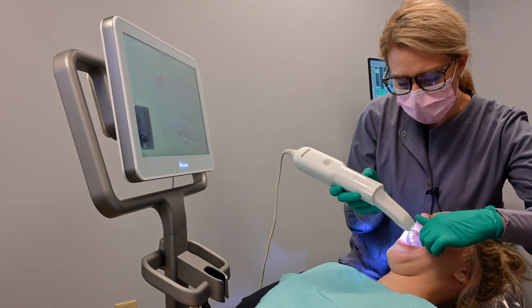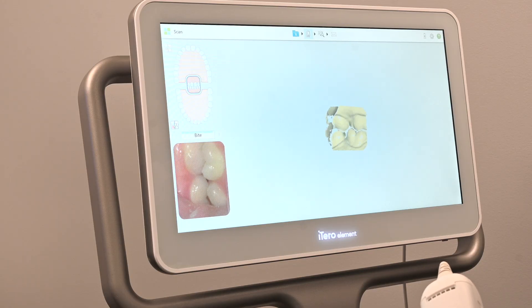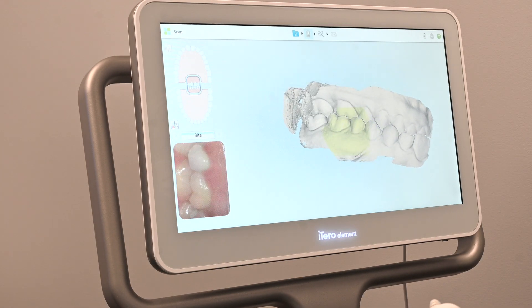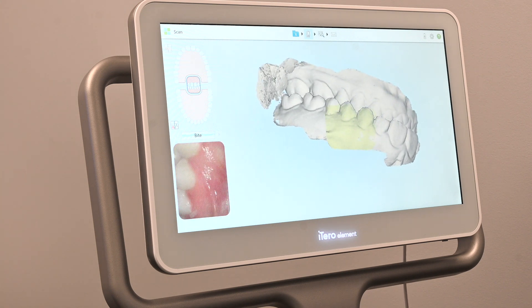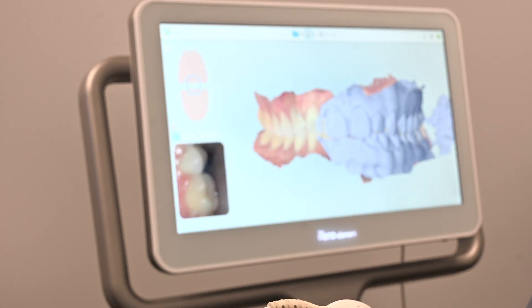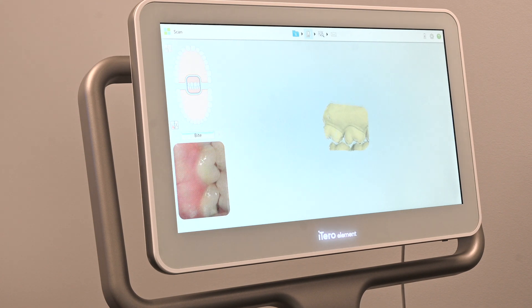I'm going to have you bite down here all the way together — just stay closed. Another way we can use the iTero is for whitening trays. It replaces the traditional impression material, so we don't have to take upper and lower arch impressions. If it doesn't capture correctly, we can just re-scan the area instead of having to take the whole impression over again.